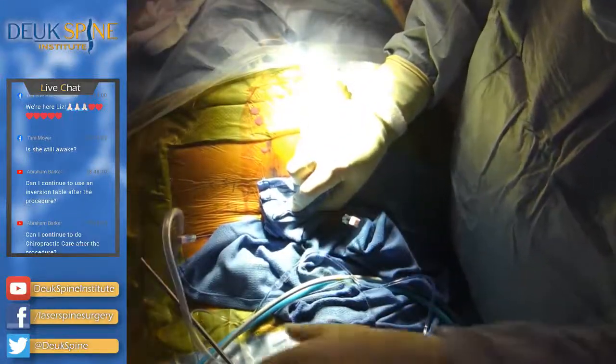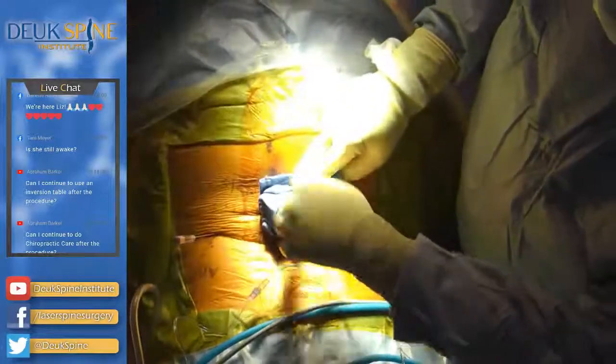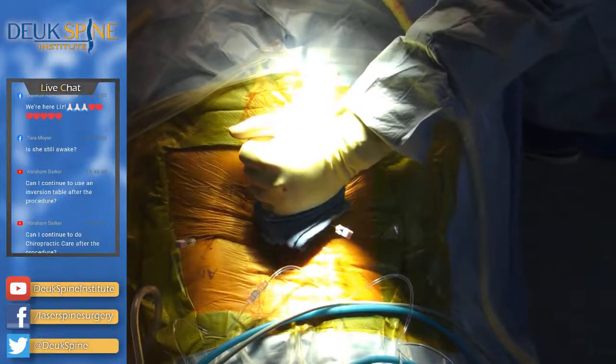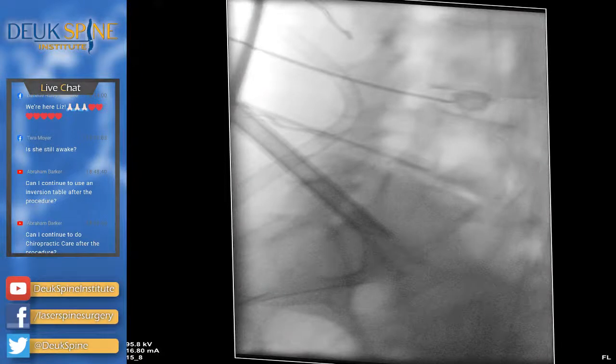And the tube we use for the lower back is bigger in diameter than the tube we use for the neck. The lower back tube is 7 millimeters, the neck is 4. So almost double the size as the one we use for cervical, which is the neck, and also thoracic. The tube we use for cervical and thoracic looks like a little metal coffee straw, lateral view. And it's just a tiny little metal tube, and we use the same for cervical as we do for thoracic.